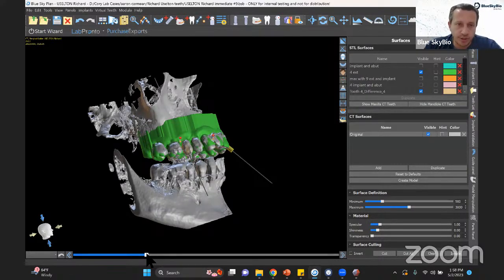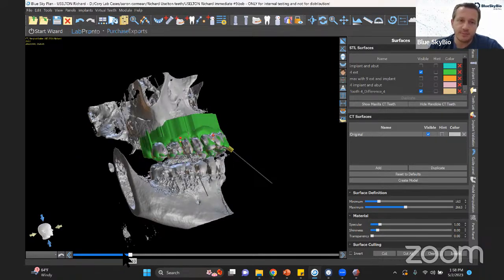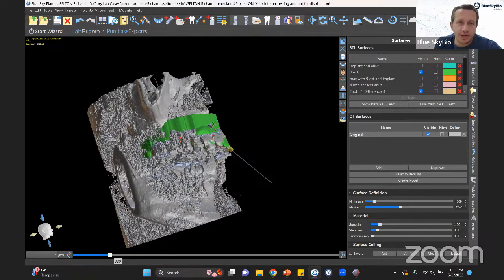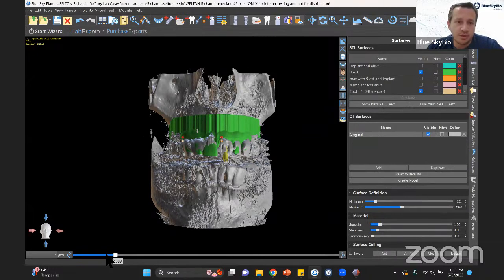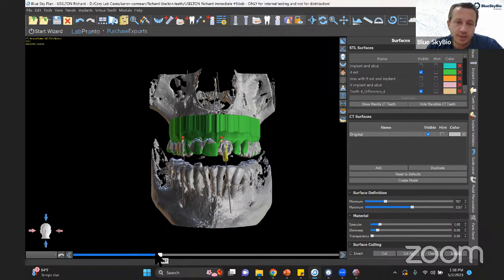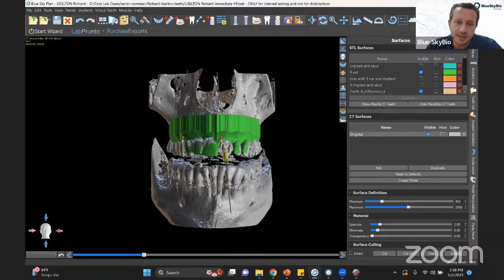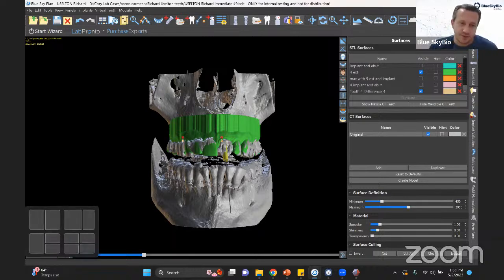It's not something that we're currently working on. I have to give it some thought. There's actually a very good video in the Facebook group. I don't recall the doctor's name. I think he's located somewhere in Iraq, maybe. He showed a presentation where he created a video showing the CT scan with the face. He cut out the area of the mouth and he had his denture set up there. So it's a bit rudimentary, but I was quite surprised by how good it looked. Regarding development, we don't currently have that in our pipeline to segment the face.